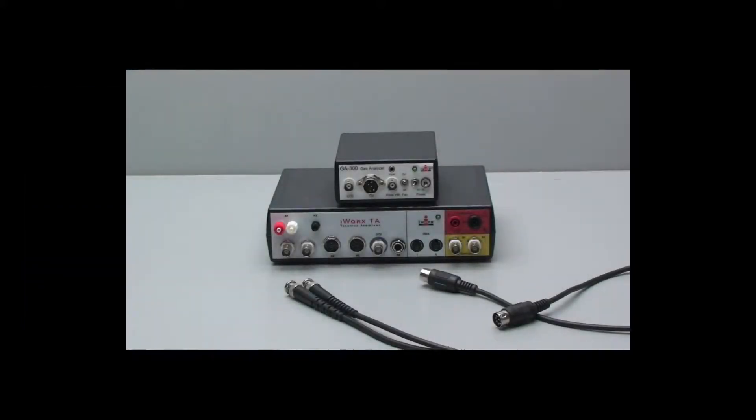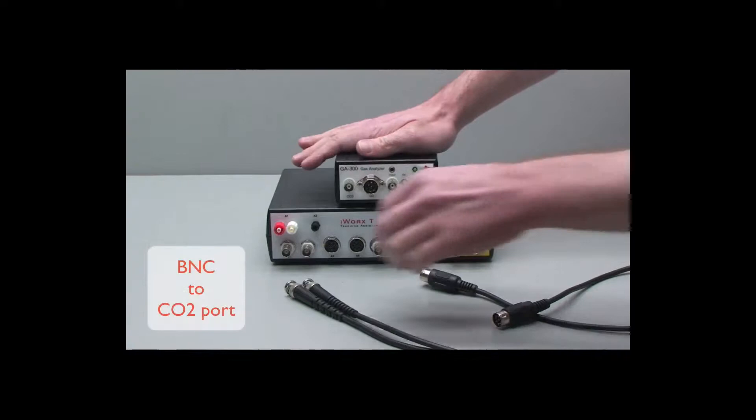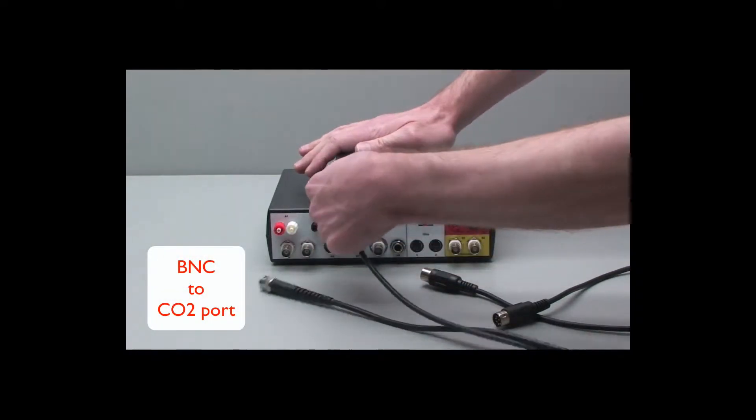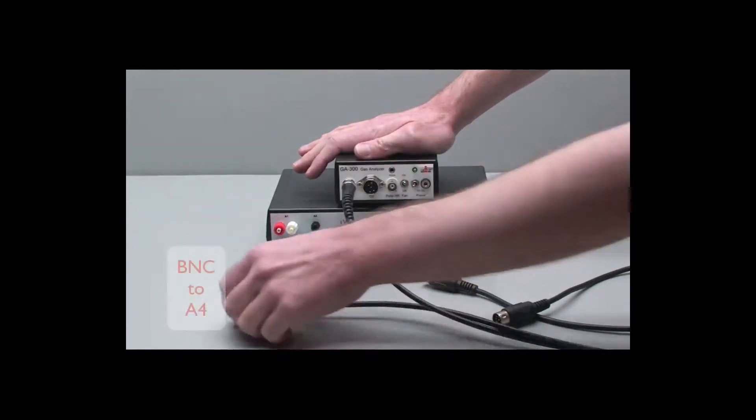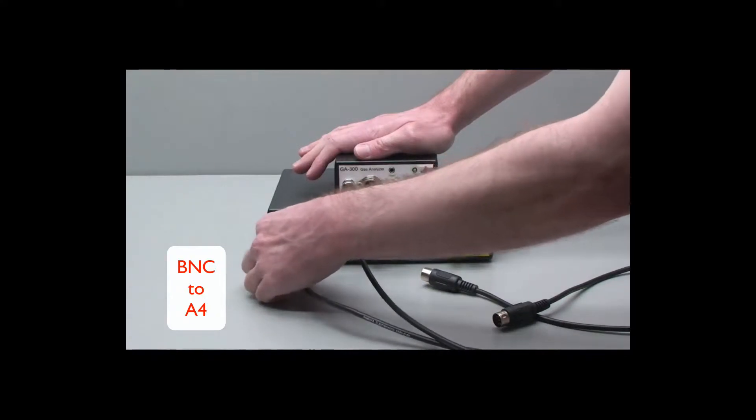To set up the components, take the BNC to BNC cable, connect one end to the CO2 port, and the other one to channel A4 on the front of the TA.